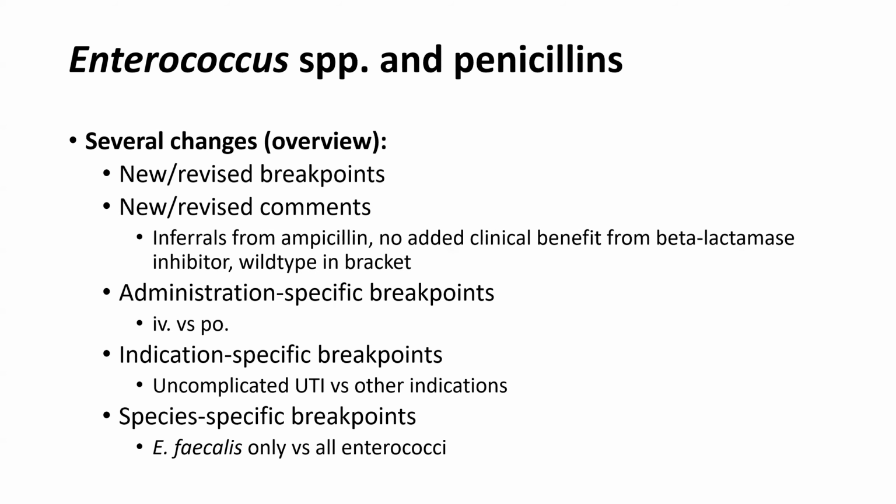And then there are several other changes, so you'll just have to read the table carefully. We'll go through most of these. There are both new and revised breakpoints, new and revised comments, also according to administration, where you have IV and oral. Also, indication-specific and species-specific breakpoints, where for some breakpoints, it now is only for E. faecalis and not for all the enterococci.